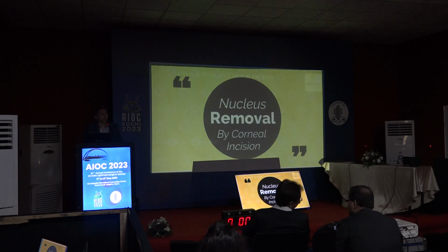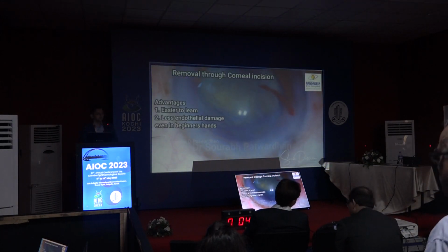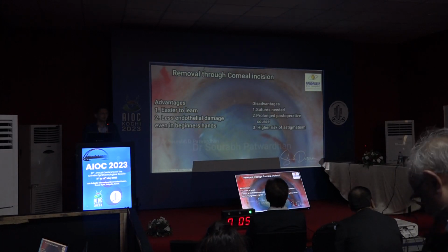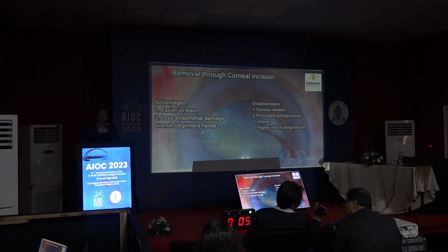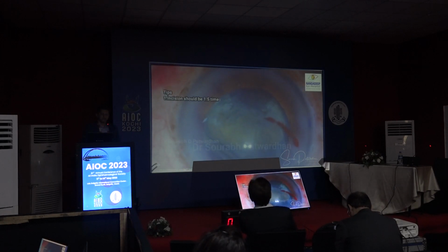Now through the corneal incision is easier to master if you are not used to SICS surgery, but again there will be problems such as you have to give very good sutures, and prolonged suture management is required to give a good refractive outcome in these cases.